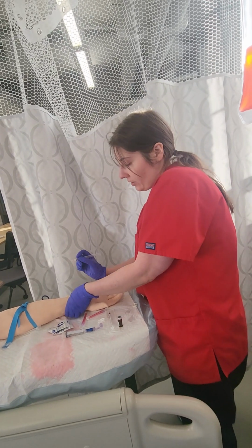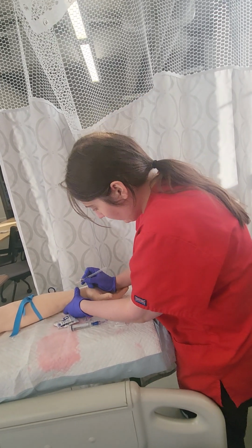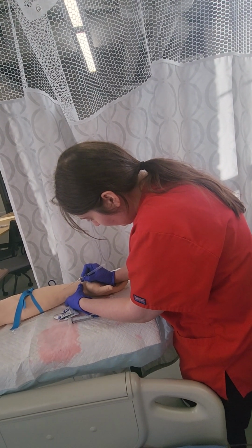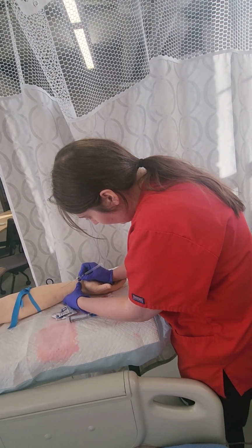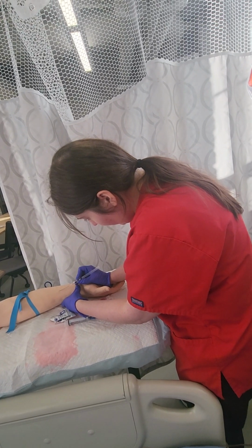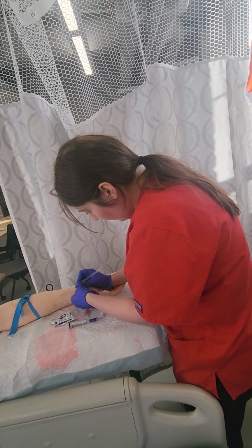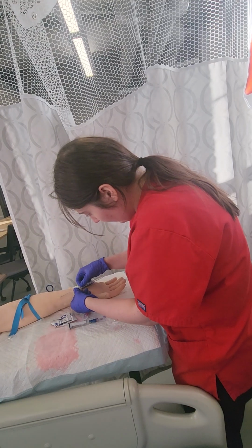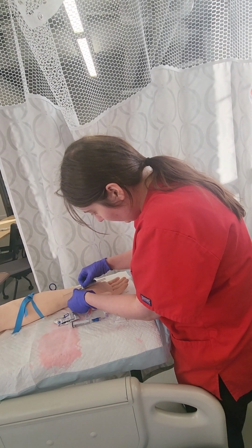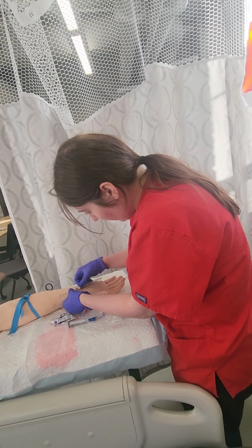I'm gonna hold underhand here. There we go. Now I'm going to insert the hub all the way up.